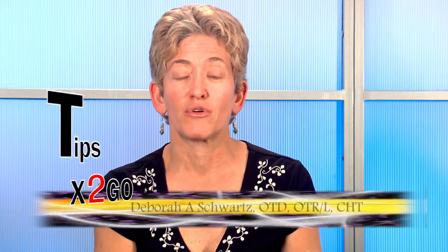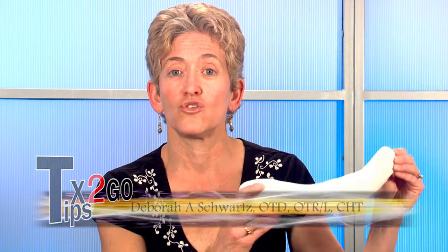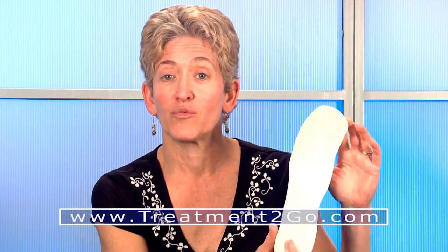Our next tip is going to be fabrication of a dorsal blocking splint. A dorsal blocking splint is used after a flexor tendon injury or nerve injury and repair when our goal is to immobilize the wrist and fingers in a position of protection, preventing wrist extension and active finger extension so that we don't rupture the repaired structures.